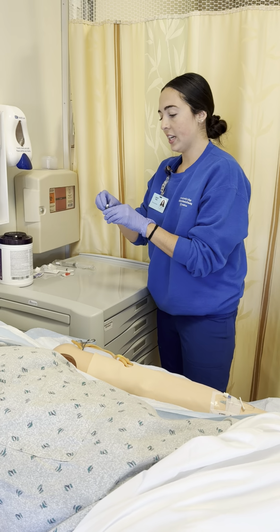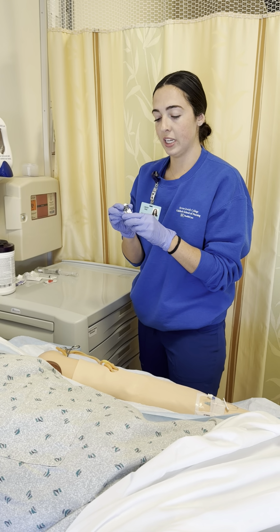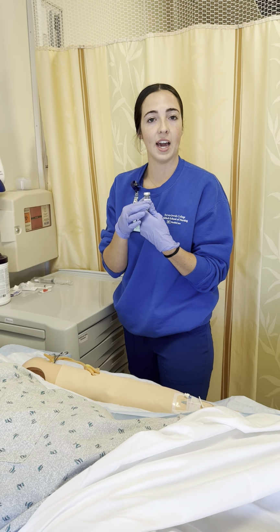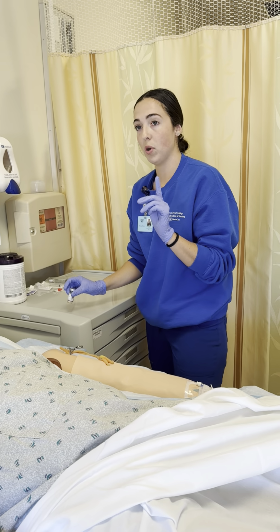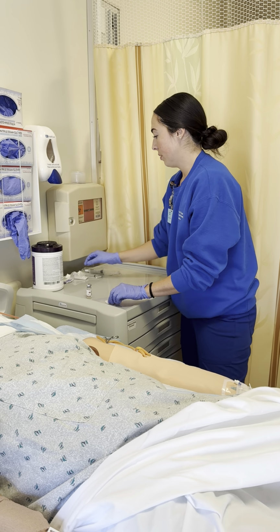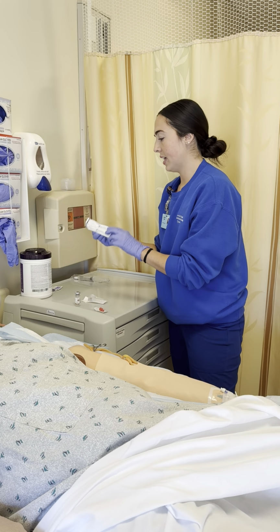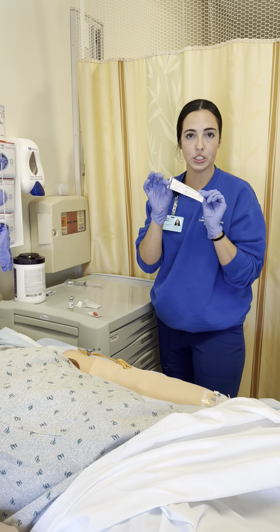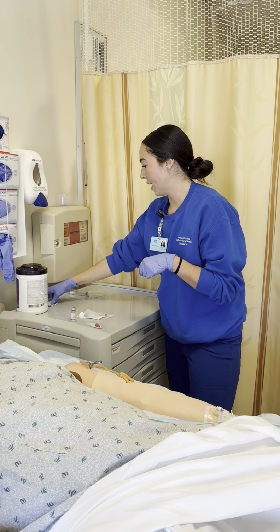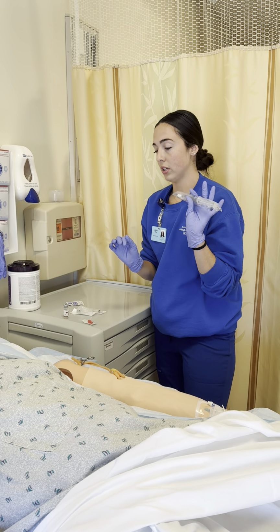So what I've got here is I have my furosemide. This is 20 milligrams per 1 milliliter. Our order asks that we give 20 milligrams, so we're going to give 1 milliliter today. Got that there. I've got my red cap. Place that to the side. I've got a needle to draw up my medication, and then a sterile syringe to help draw that up. I've got 2 alcohol prep pads and a sterile flush.